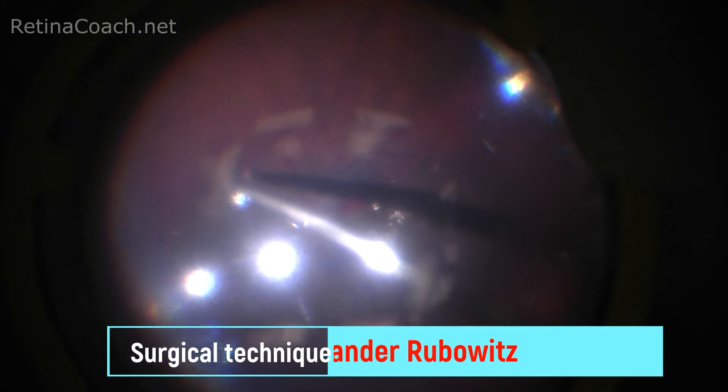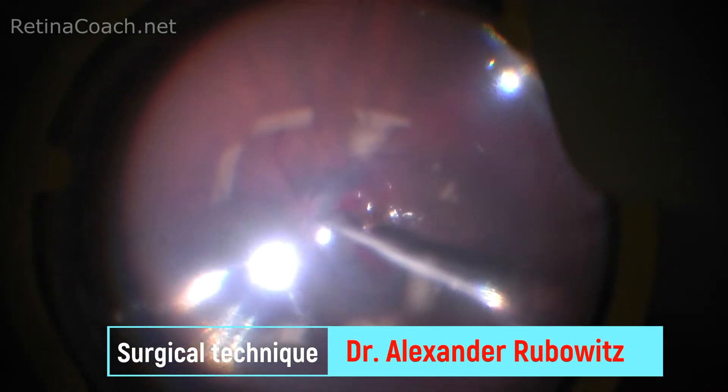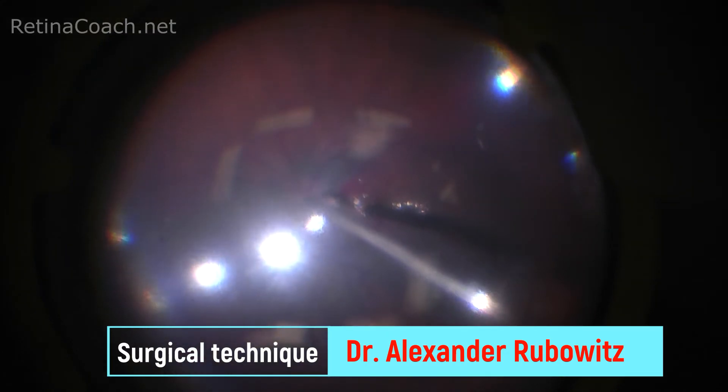PFC is a surgical tool and it's important to assure proper removal of all liquid at the end of the case. In routine surgery, the removal of PFC is performed after full reattachment of the retina and fluid-air exchange.